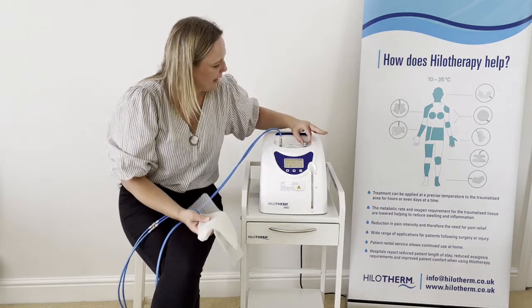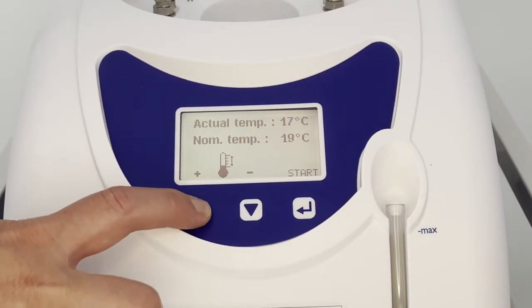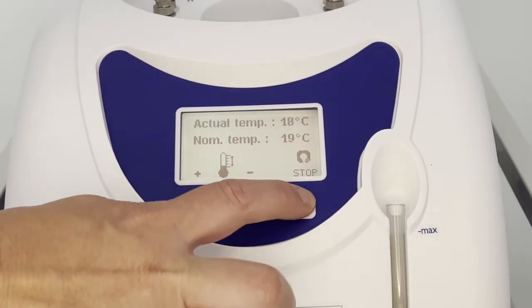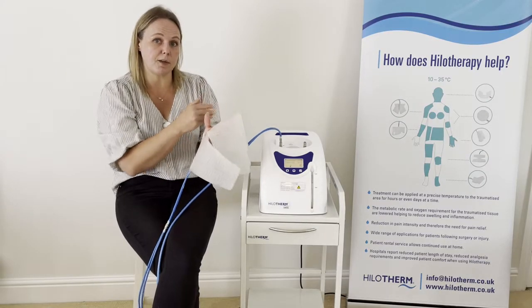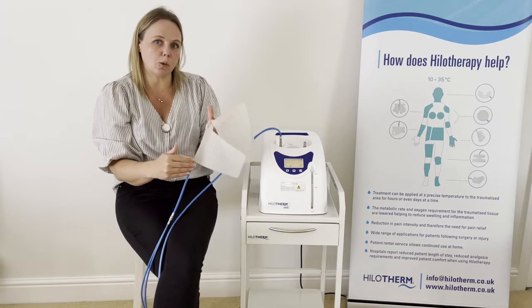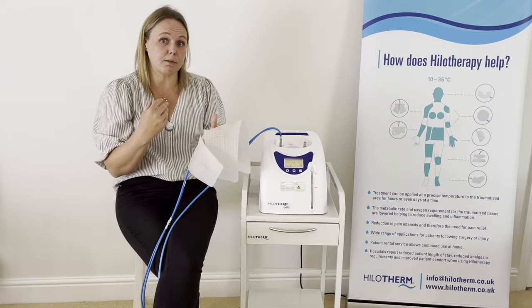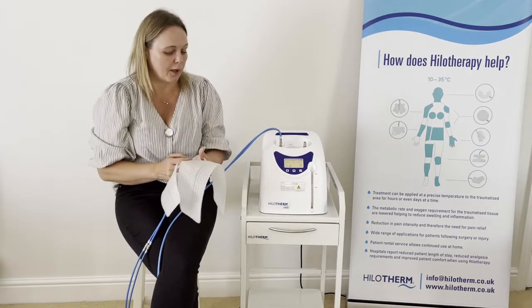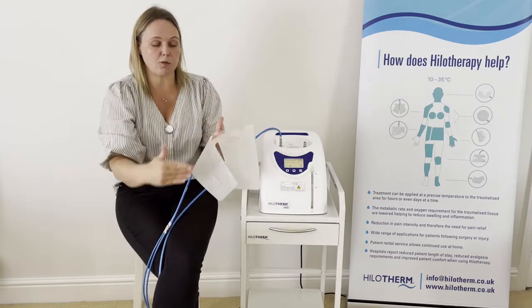I'm going to start the water flow now, checking that everything is safe. In terms of troubleshooting, you want to make sure that the water is travelling all the way around the cuff. If the patient tells you the cuff doesn't feel cool but the actual temperature is correct and at the nominal temperature, the most likely cause is some kind of impingement or disruption to the water flow.